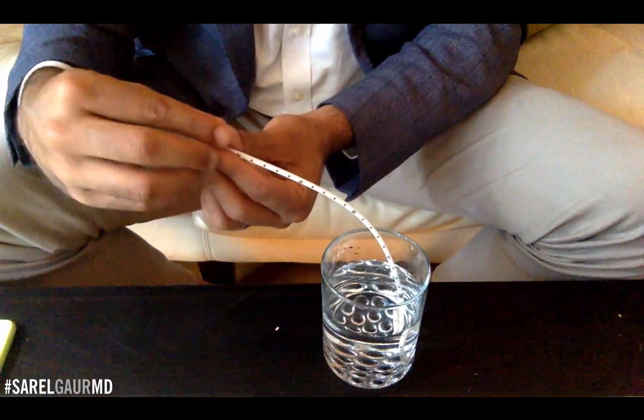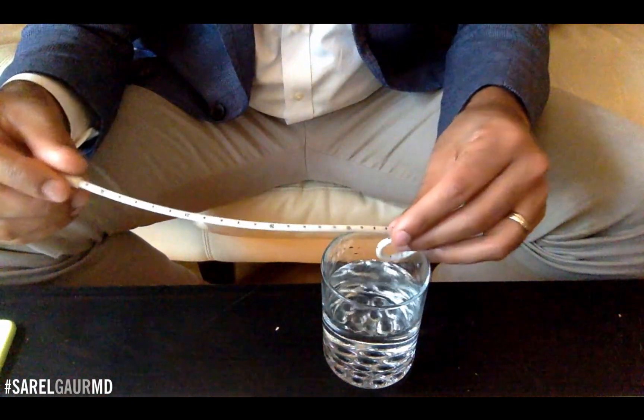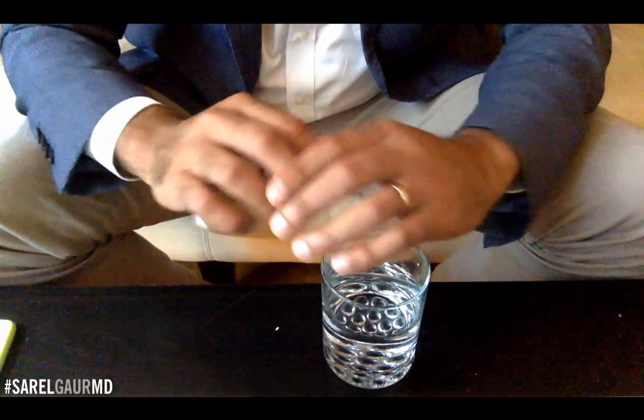Whether that's an abscess, whether that is a blocked kidney like a nephrostomy — that's all the catheter is about.